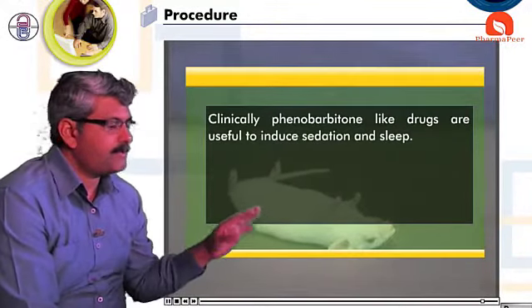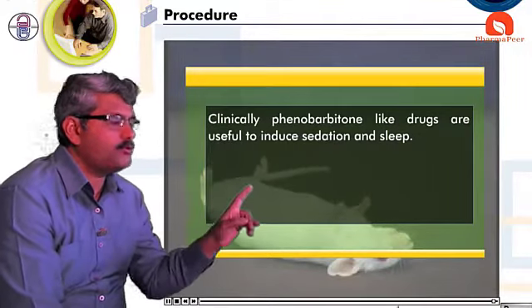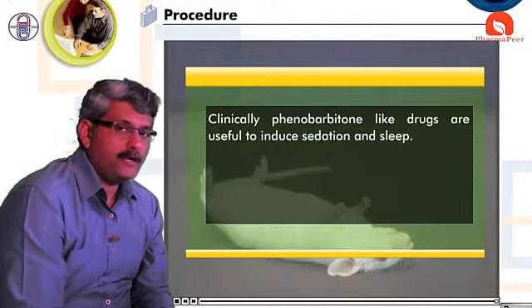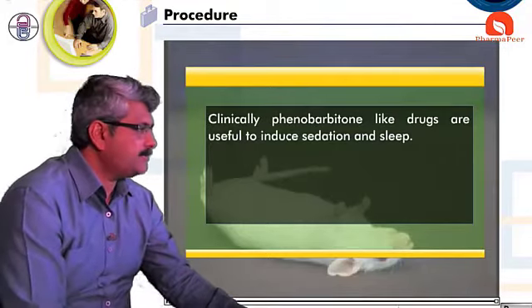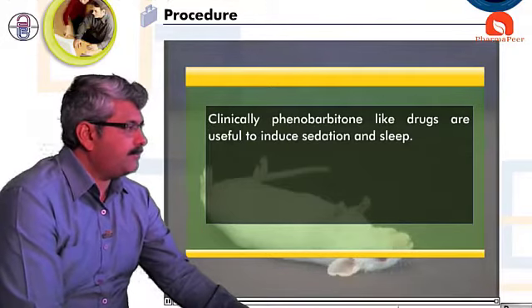And that's why we can say that clinically, phenobarbital-like drugs can be useful in induction of sleep. Induction of the sleep is the main intention. That is the main purpose of conducting this experiment. So this is an experiment about hypnotics.